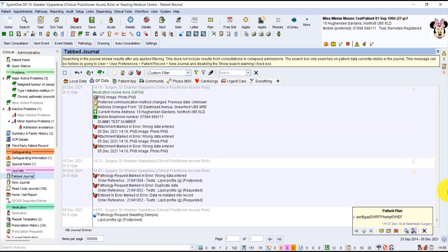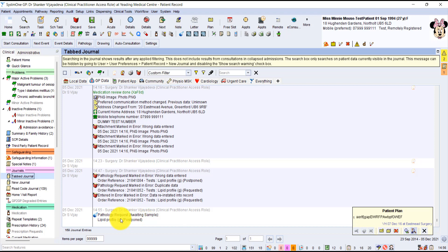So if we look at the notes again, at the bottom here you can see Pathology, Waiting sample. And that's for lipid profile.